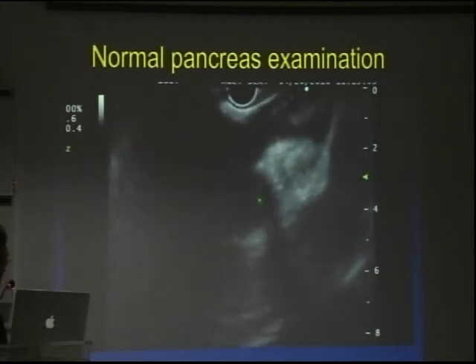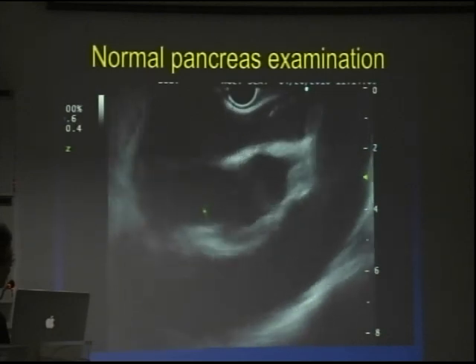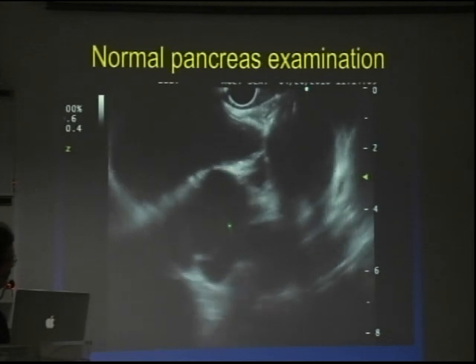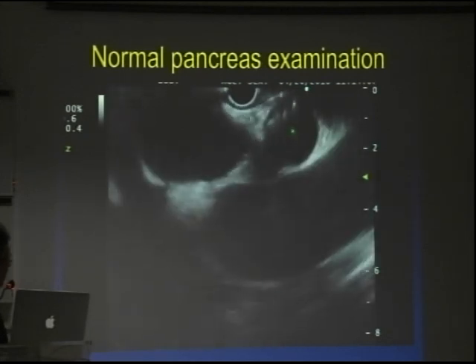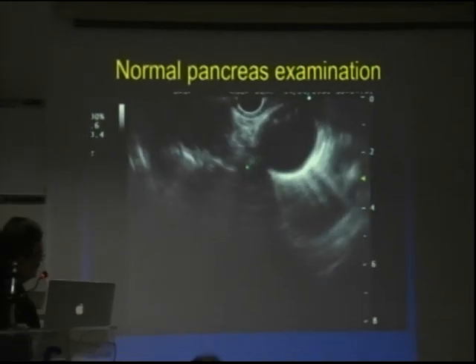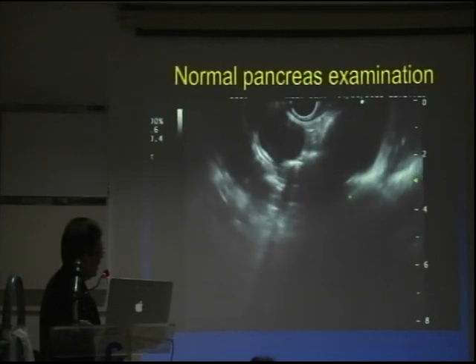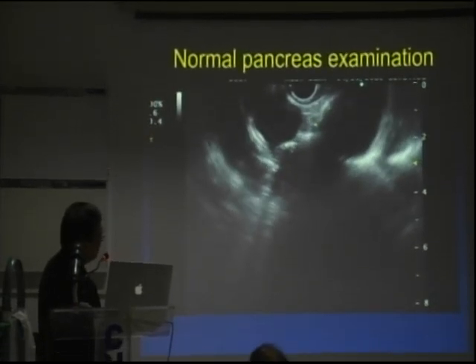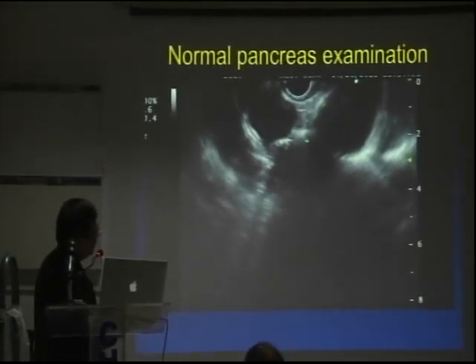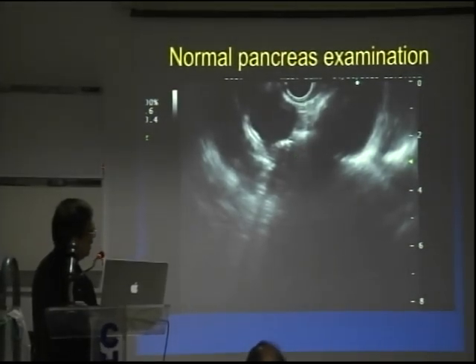And this is the mediastinum, and this is the left atrium right there, ventricle here, aortic valve right there, pulmonary artery on the top. This is the aorta, descending aorta. And then again aorta and pulmonary artery. What we call the AP window, which I think Mustafa cleared earlier, is really here, not here.